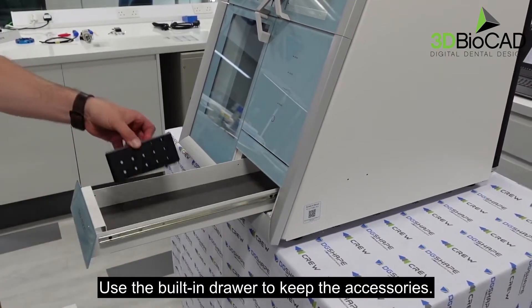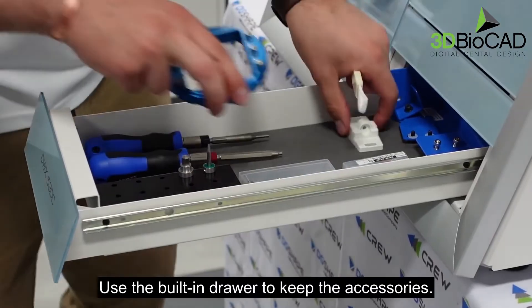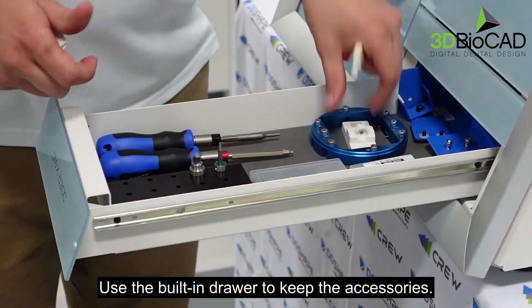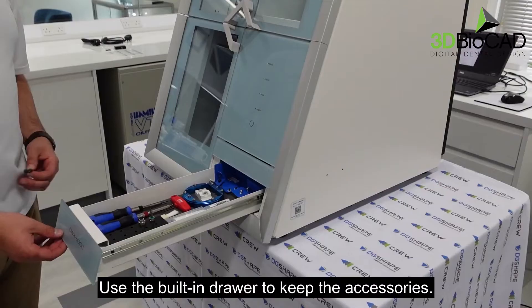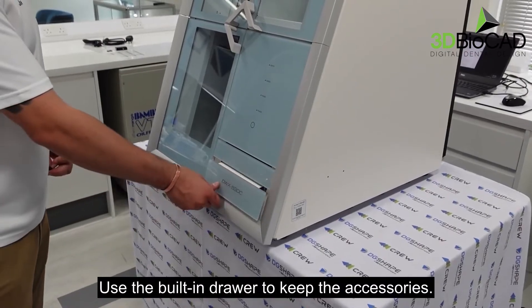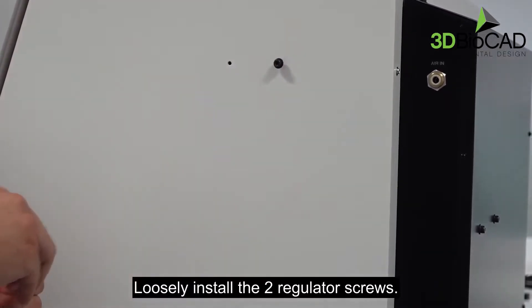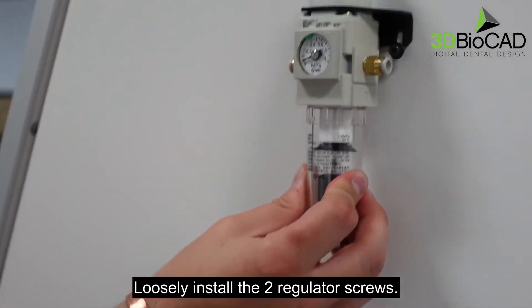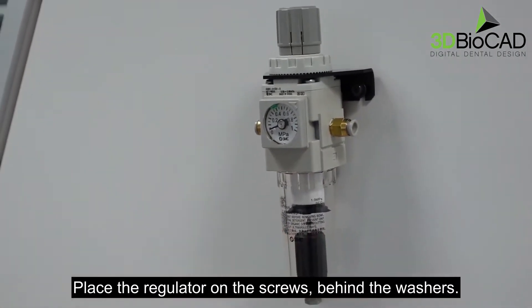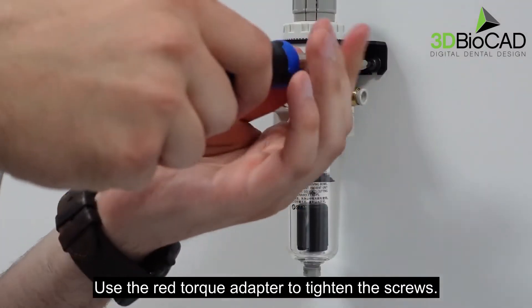Use the built-in drawer to keep the accessories. Loosely install the two regulator screws. Place the regulator on the screws behind the washers. Use the red torque adapter to tighten the screws.